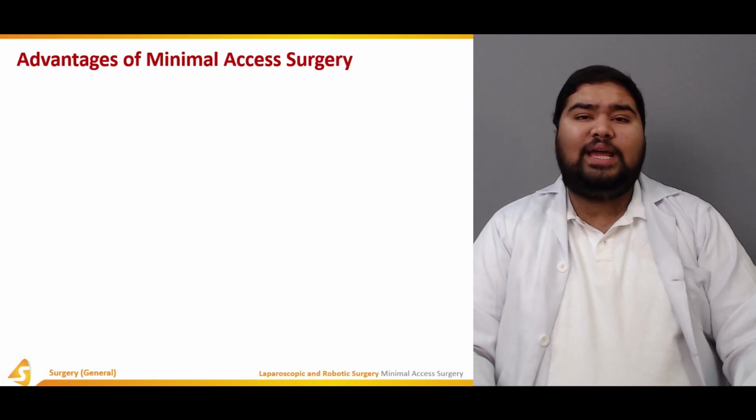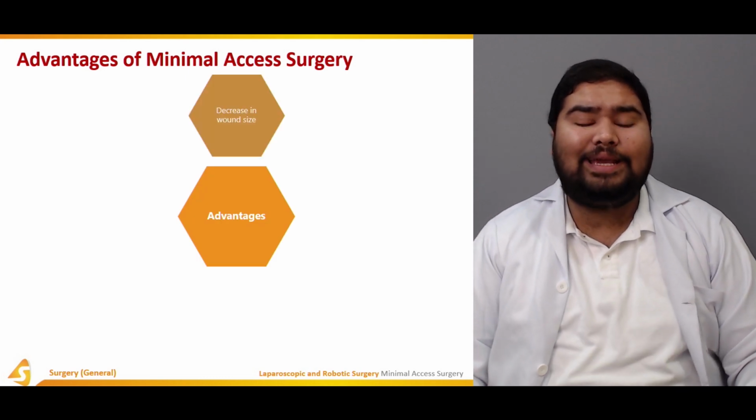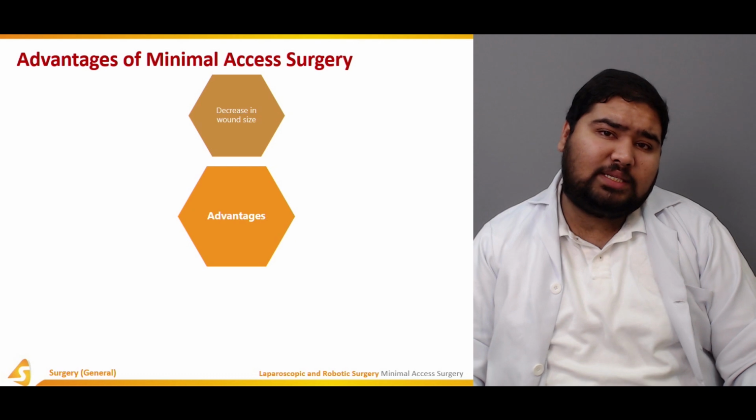Now, what are the advantages of minimal access surgery? The advantages include a decrease in the wound size, the biggest advantage, which gives better cosmesis.